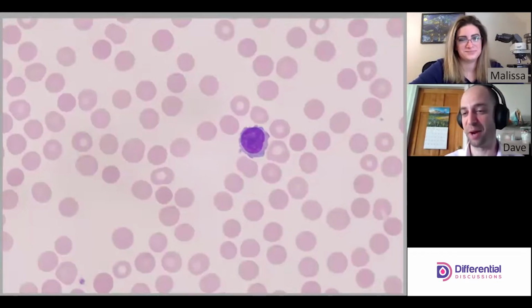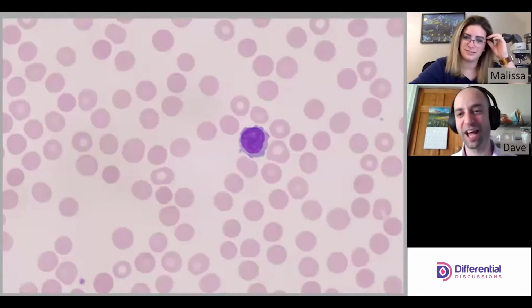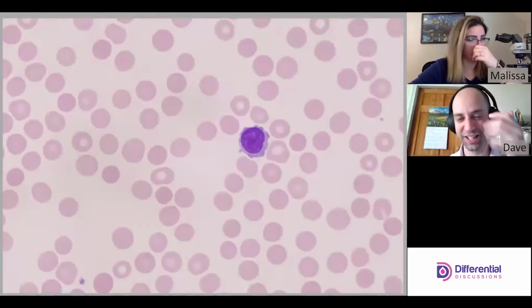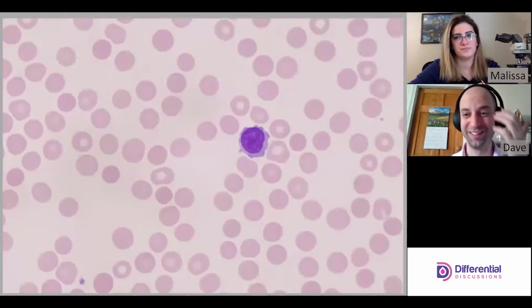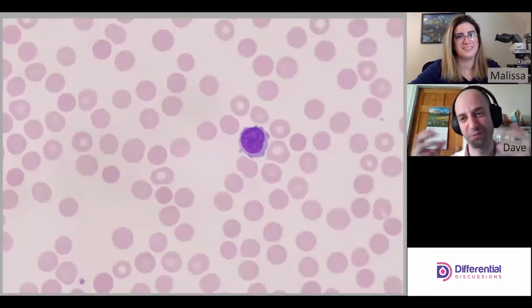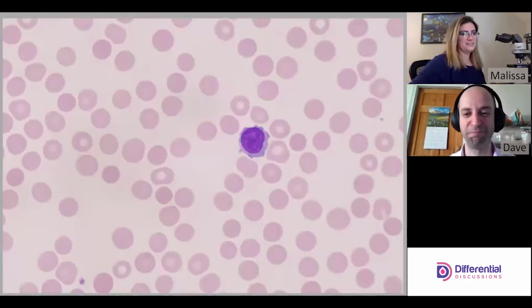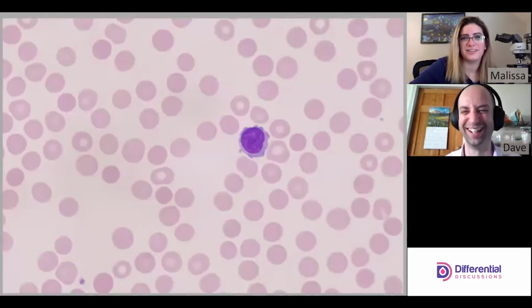Now our students will begin to see a lymph, and then this one has a small nucleolus there. Now we have to tease out normal from abnormal, and talk about nucleoli in lymphs. It's the challenging part.